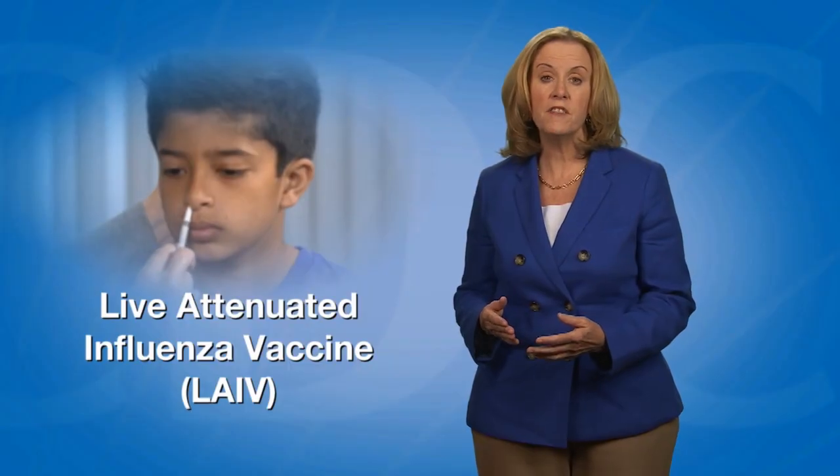In this video, I will demonstrate how to administer FluMist, the live attenuated influenza vaccine, or LAIV.